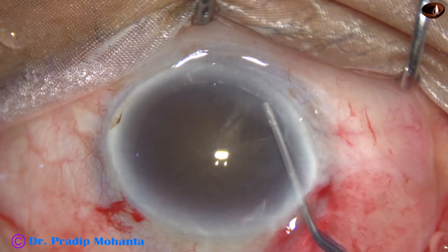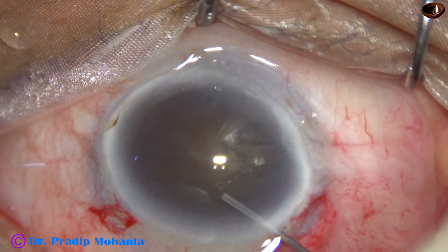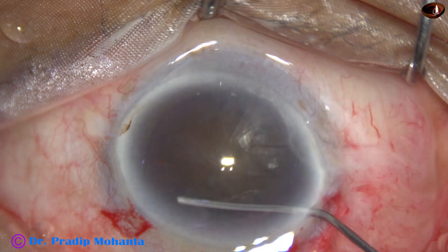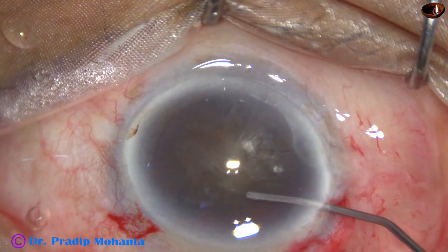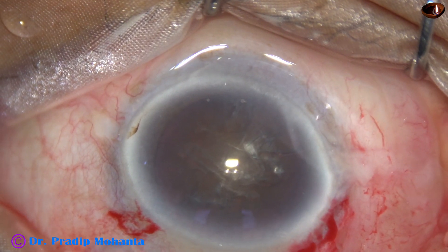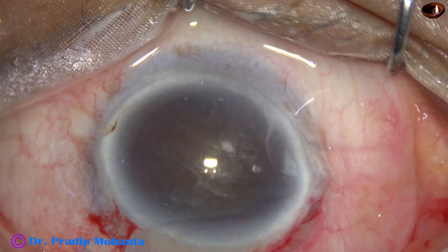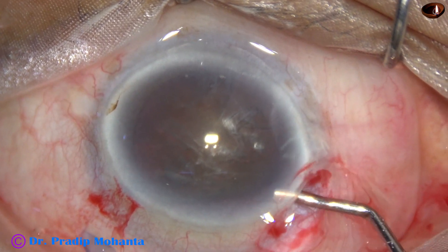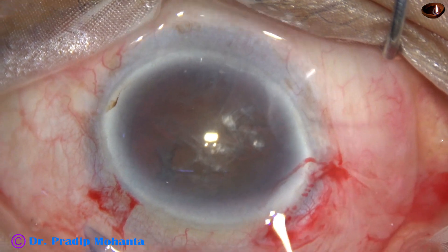Now hydrodissection. A small amount of BSS is injected at multiple points. The nucleus is gently tapped. Now a little bit of visco. My plan is to rotate this nucleus bimanually in this case.